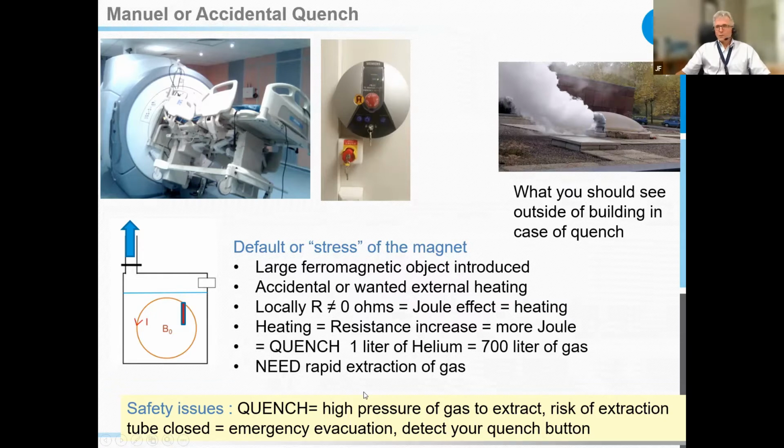So you have to understand that helium is always here. The magnetic field is always here. So you have to know that the system is a superconductive system, and you have to know how to stop this.